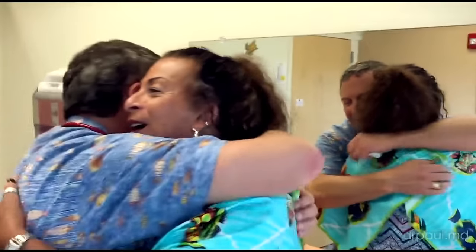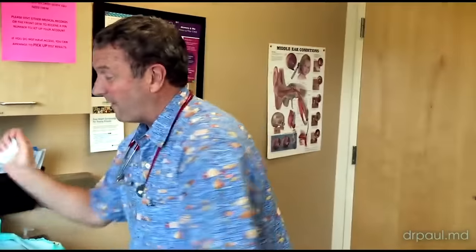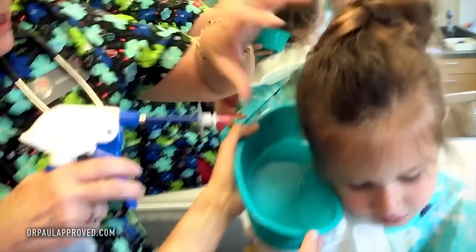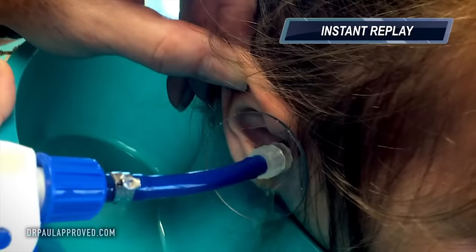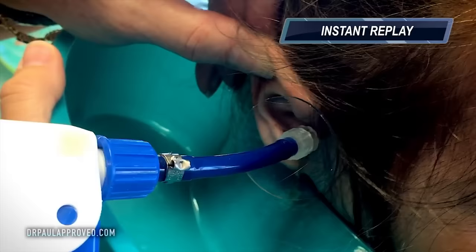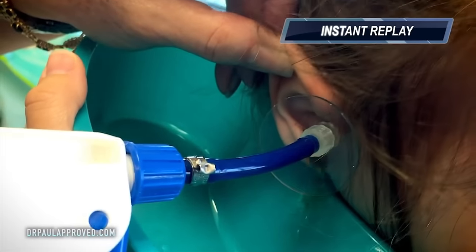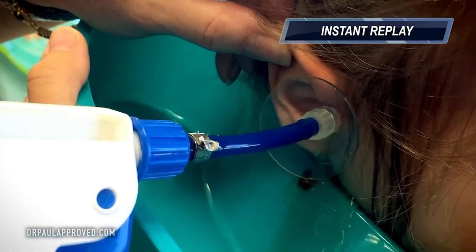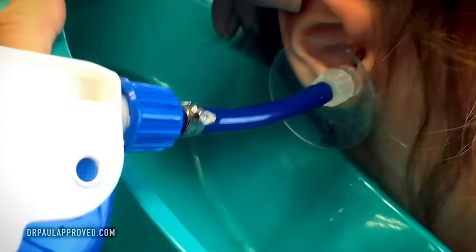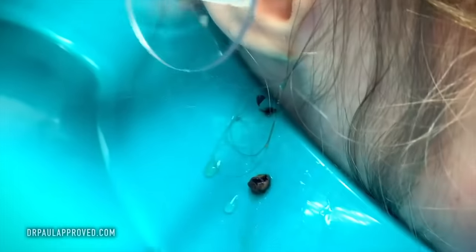Hold on. Here we go. I was just trying to get that off. I don't do that to all the ladies — just my wife. It's water, okay? There it is. There it is. Wow, there's more. There's a big loaf.